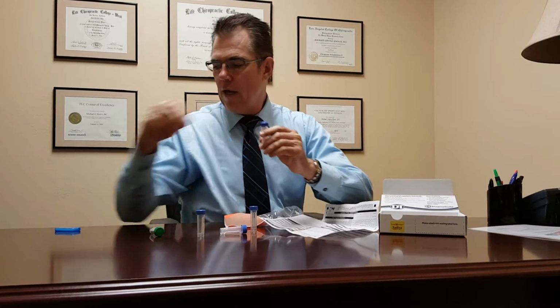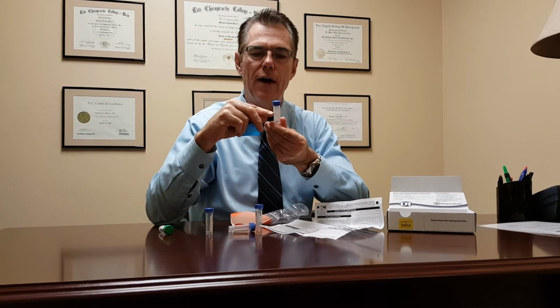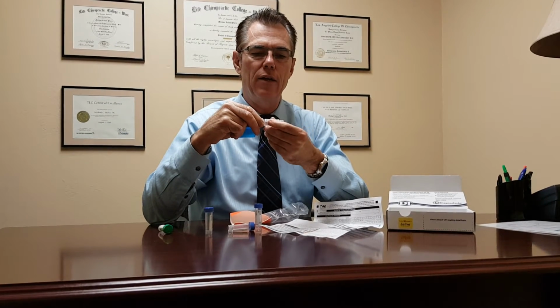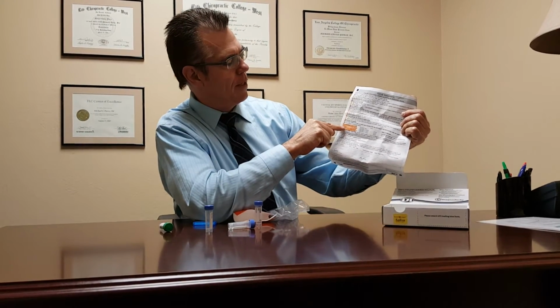You will drool basically to fill this container up to the 5 mark. We include in there dental wax that is unflavored. Take 1 strip of the dental wax and chew it, and it makes you salivate heavily. So you will take about 10 to 15 minutes oftentimes to fill this up with drool until it fills up to that 5 line right there. And then you're going to write your name and birth date on this and seal it and leave it in the box.